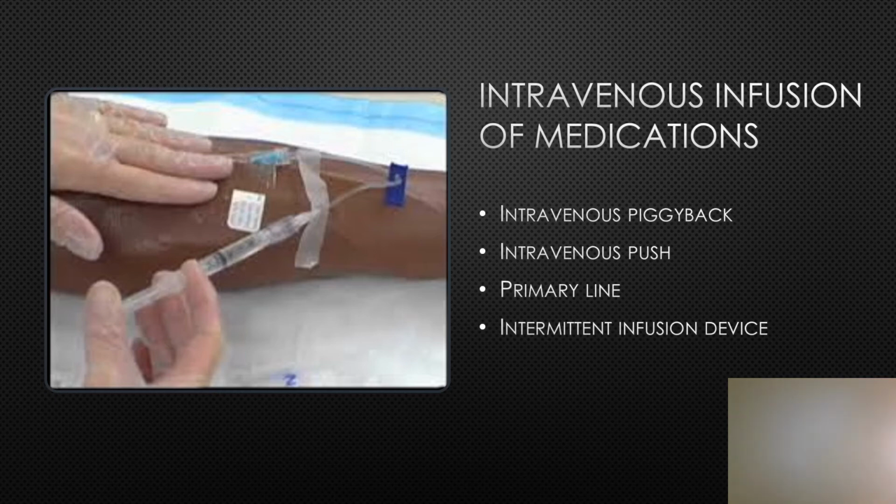Your high-risk infusion medications are going to be heparin, thrombolytics, insulin, narcotics, promethazine, potassium. Always double check those medications and your calculations, dosages, infusion rates with a second professional prior to administration. Then, you're going to label the medication, including the client's full name, date, name and amount of IV solution used to dilute the medication, the name and dose of the medication, and the rate of infusion.